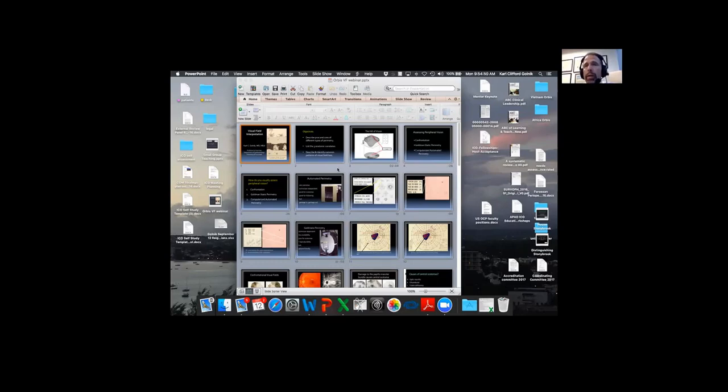So if you have a small scotoma and you do a 24-2 or a 30-2, you might miss it, whereas you might find it on a 10-2.